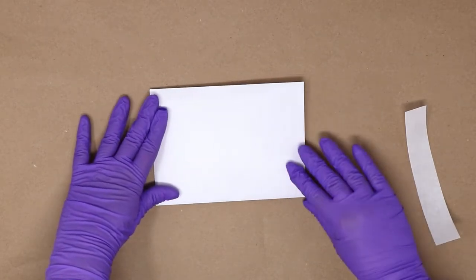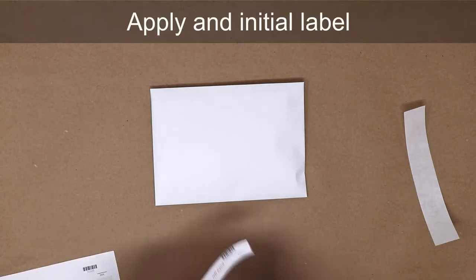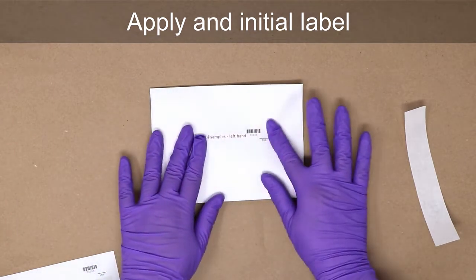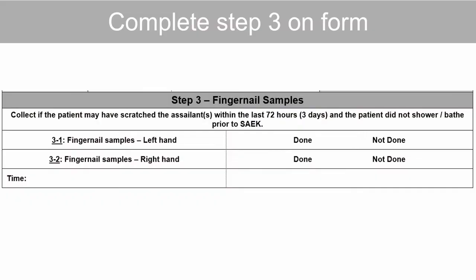In this case, 3-1. Left hand fingernail samples, and initials can be added to that label in the top right. The paperwork can then be completed by circling Done for each of 3-1 and 3-2 and adding the time of collection.